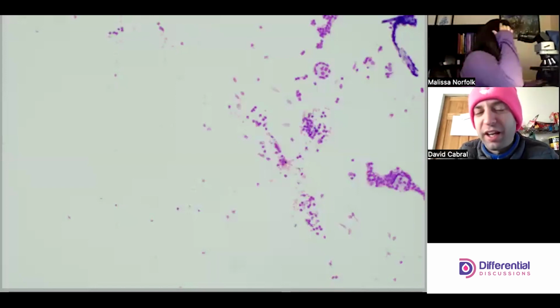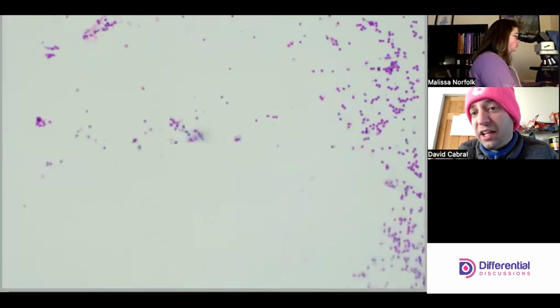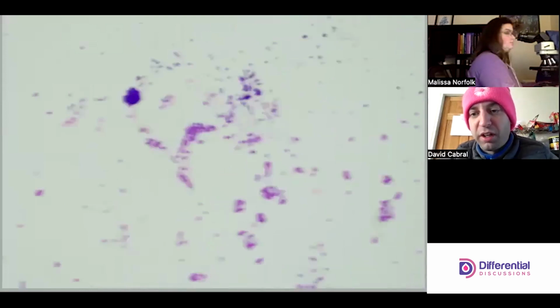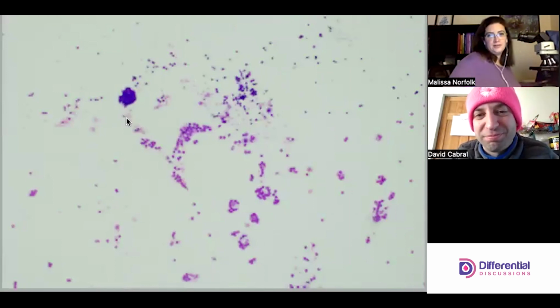So, of course, we're starting at our low magnification, and we're taking a look around for any kind of signals, maybe stuff that we might want to focus on. Right away, I see a lot of mononuclear cells, and by mononuclear, I mean round balls. They're probably lymphs. Although this thing here is a big giant blob. Ugly.